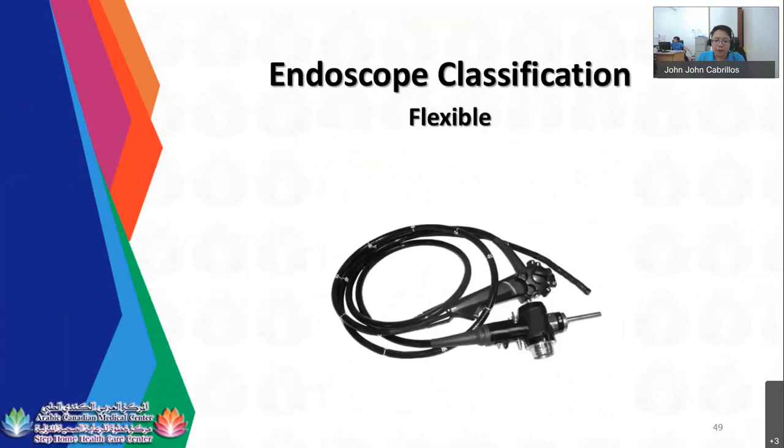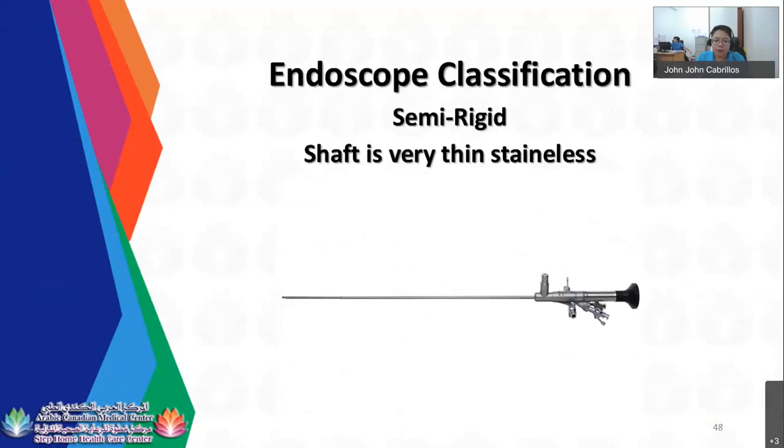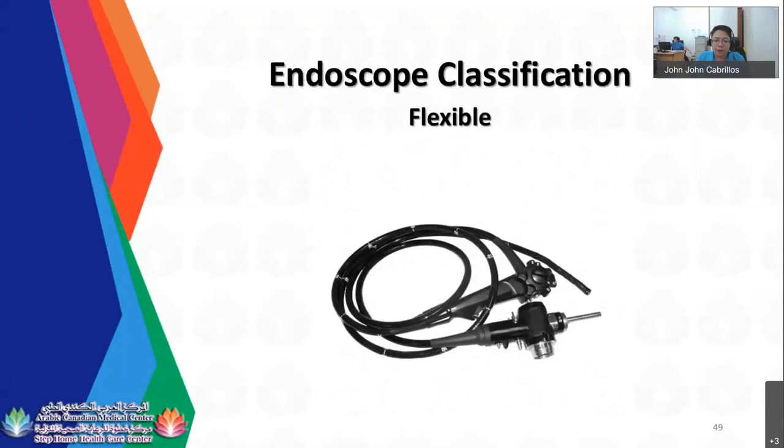For your flexible endoscope, this is the sample of your flexible endoscope. It is used where straight line access is not possible. If your rigid endoscope is not applicable, they cannot use it, then they need to use your flexible endoscope, especially in the esophagus. If they are going to your esophagus, then they need to use a flexible endoscope rather than semi-rigid or rigid endoscope. Or when your doctors need to check or do a biopsy on your lungs or kidney, then they will use a flexible endoscope.